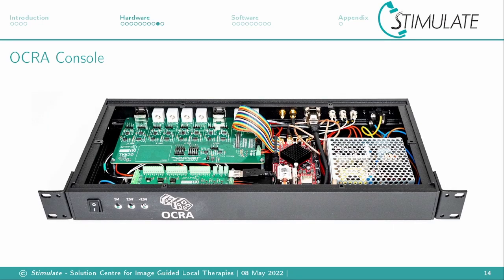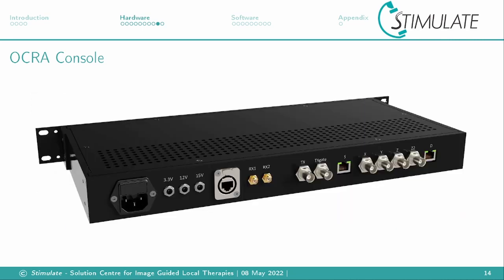You can see a big power supply and a power distribution printed circuit board, the RedPitaya microcontroller and the OCRA board. This is the backside of the console with all the connections. The connections and signals are really general, so you can connect almost any MRI to it.